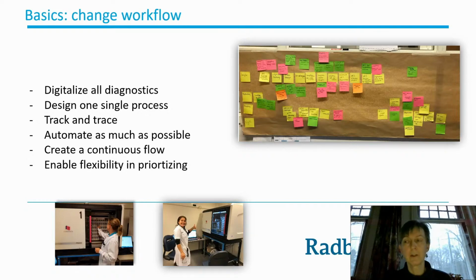It's not possible with the manpower that we had. So we really had to go all the way and design one single process for all the diagnostics. Essential in this process is to have a good track and trace system with barcode scanning from the very beginning of the tissue when it arrives at the lab until the last report that is sent out.